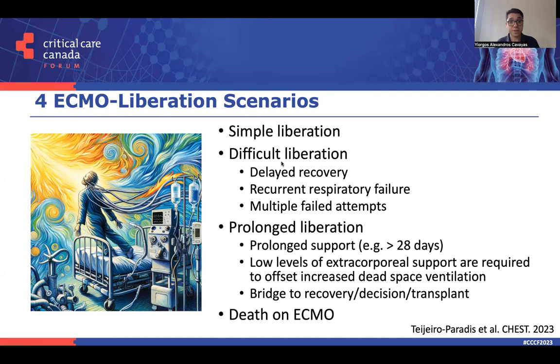However, in other patients with delayed recovery, recurrent respiratory failure, or having had already multiple failed attempts, where we could qualify the liberation as difficult, a strategy of progressively decreasing the ECMO support probably offers the most advantages.